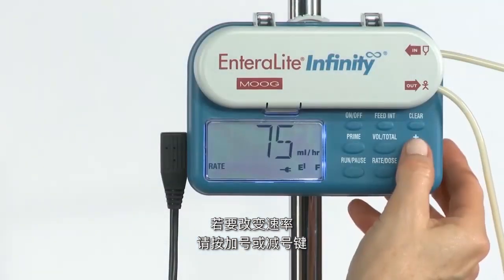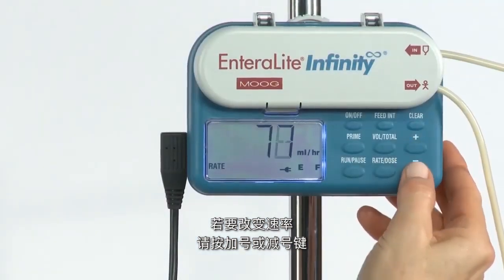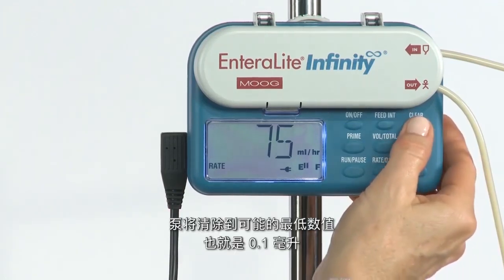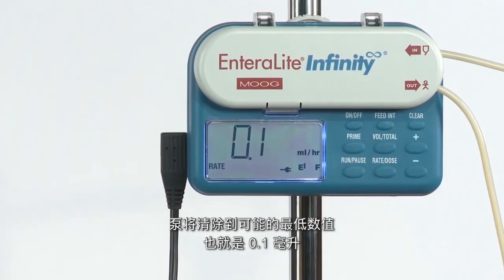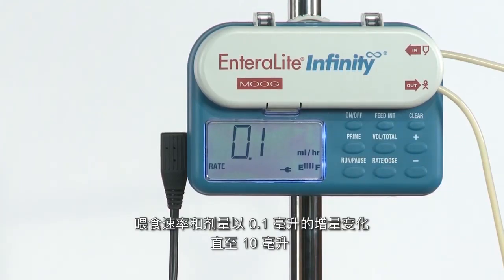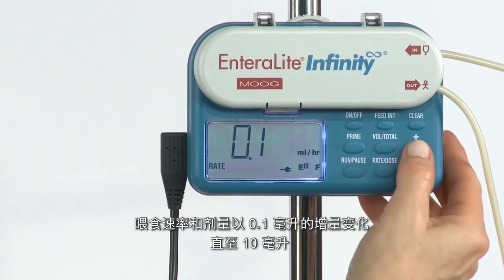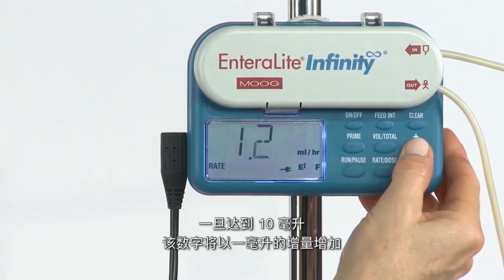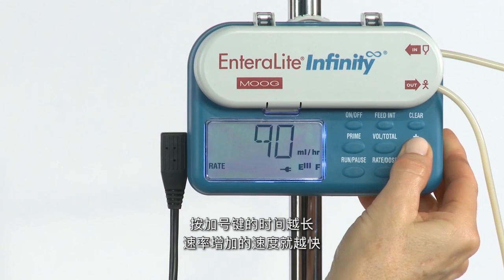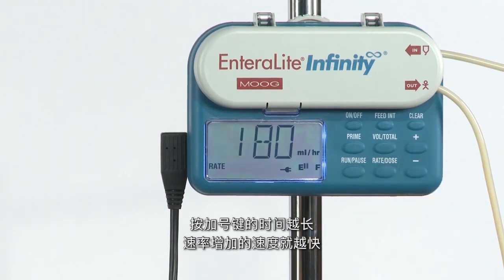To change the rate, press the plus or minus key. If the clear button in the upper right-hand corner is pressed, the pump will clear to the lowest possible value, which is 0.1 milliliter. The feeding rate and dose are changed in increments of 0.1 milliliter up to 10 milliliters. Once 10 milliliters is reached, the numbers will increase in increments of 1 milliliter. The longer the plus key is pressed, the faster the rate will increase.